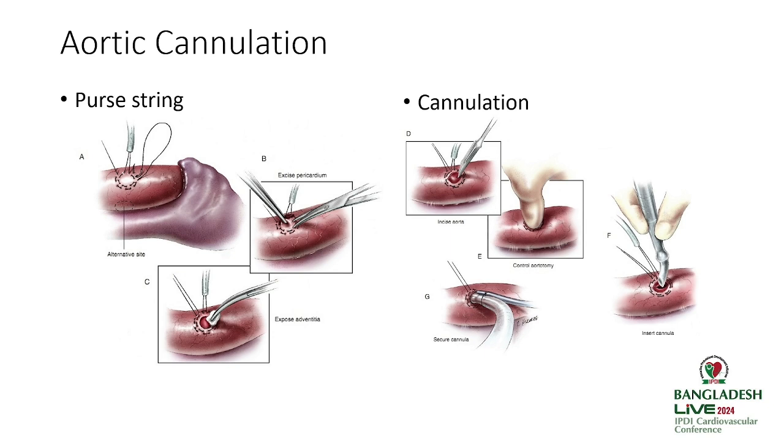And then you insert the cannula. After that, you tie down the snuggers on both sides, and then usually we do two encircling ties with the cannula, and on the flanges we have the snugger tubes.